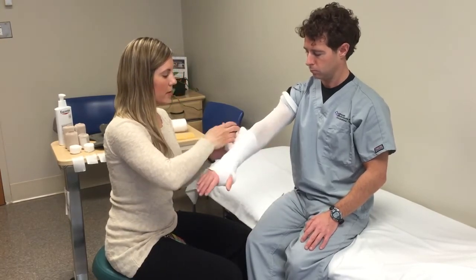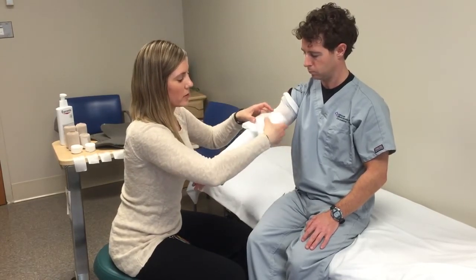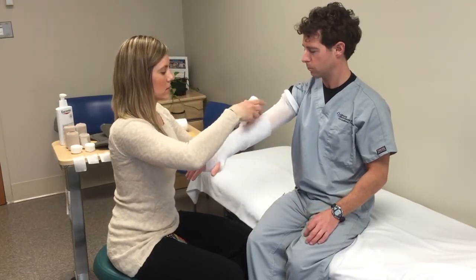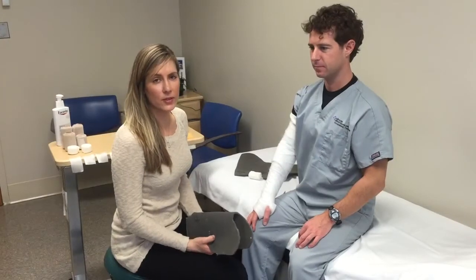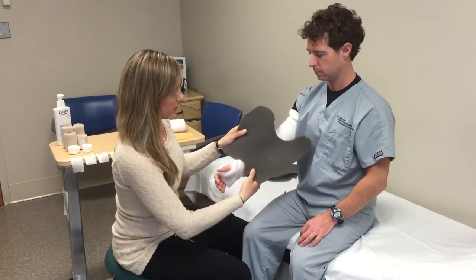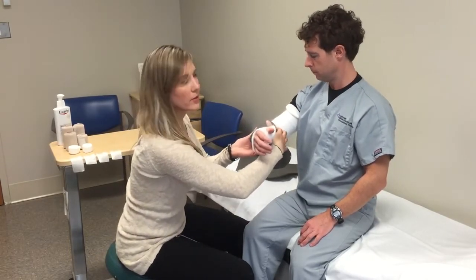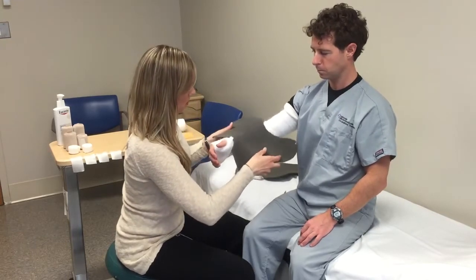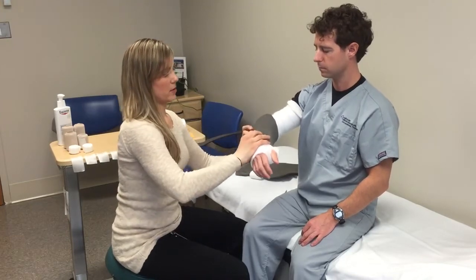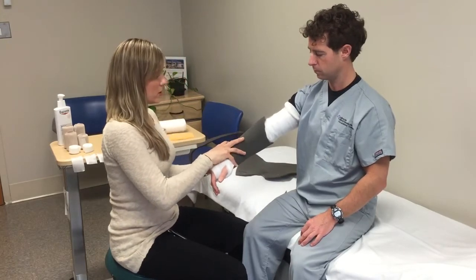When you get to the elbow you can reverse your direction just to give a little extra padding here, and then you continue spiraling. If you're using foam that your therapist cut for you, apply it now — apply the lower half first, lining it up as your therapist showed you, and making sure that you're not covering the crease of the elbow.